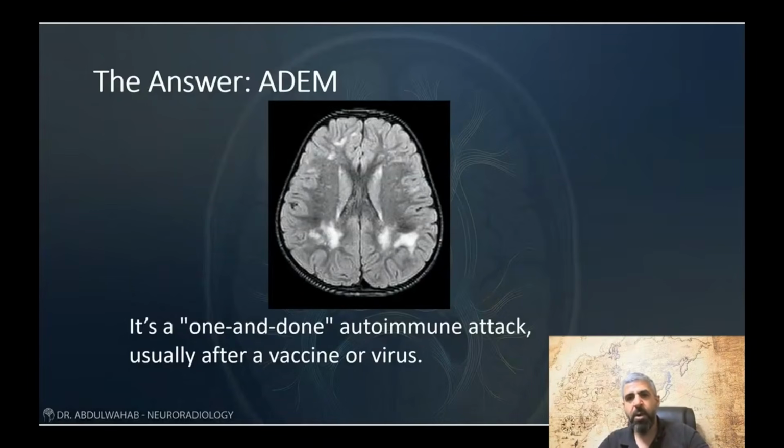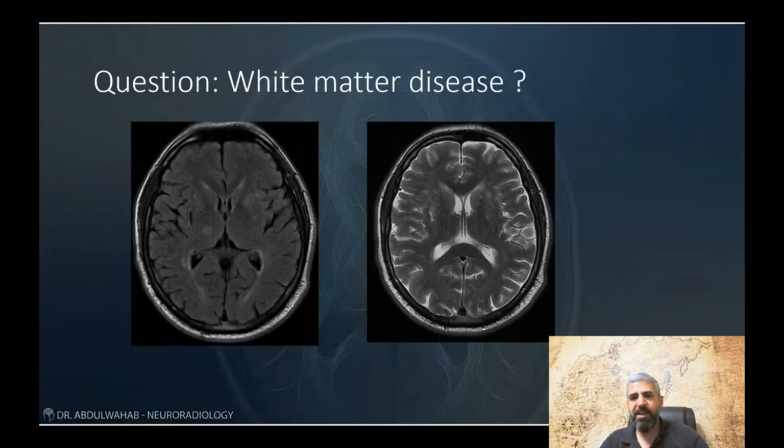Unlike MS. Now, question: is this a white matter disease? Let's go to the next case. I will not give you the answer now. The answer will be revealed in the next case.